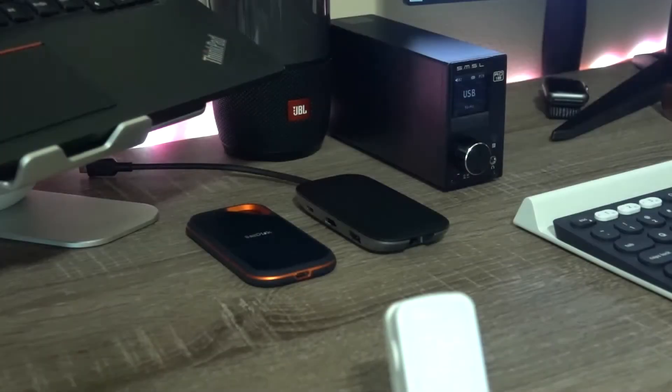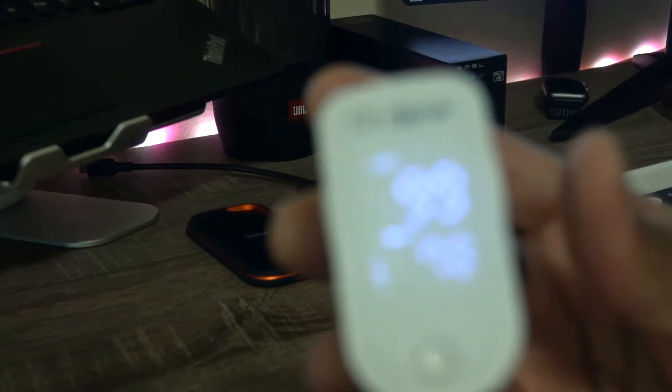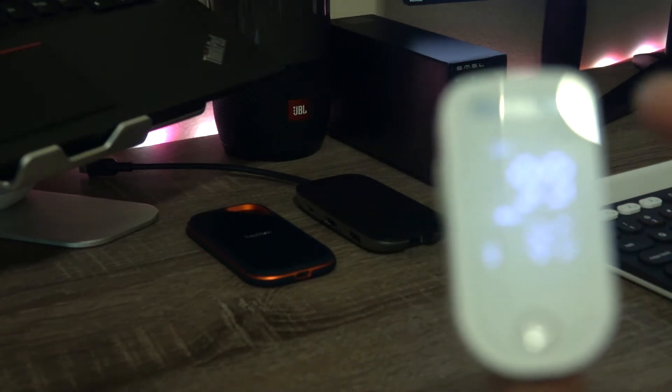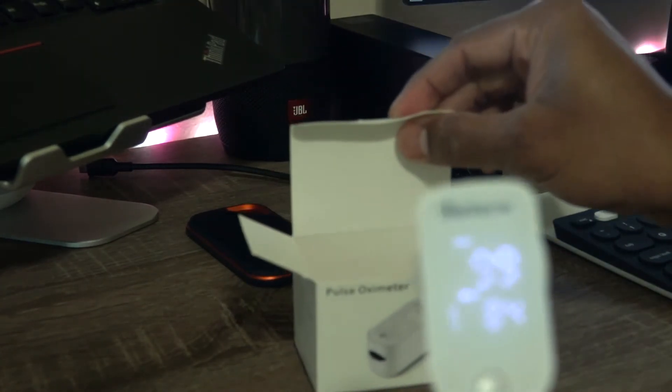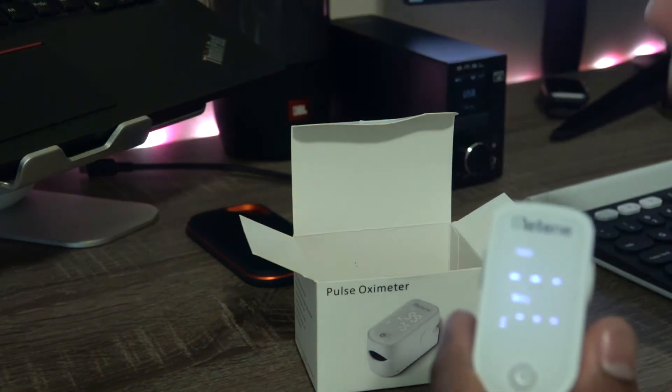Powering on — just click the button and it powers on. Let's see how it works when you put it on your thumb or index finger. It is displaying — I'm not sure if my camera is able to focus, but it shows my SpO2 level is 99 and my pulse is around 73. It keeps changing since I've been talking. Yeah, it's 99 and 82.